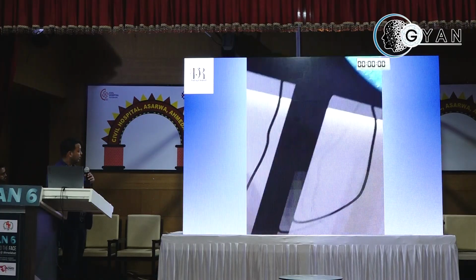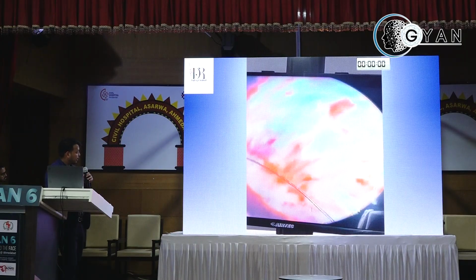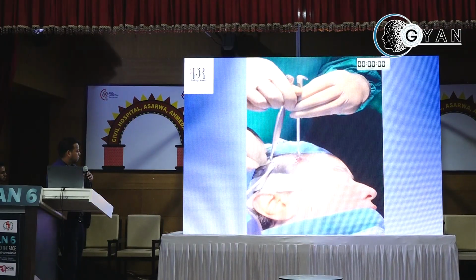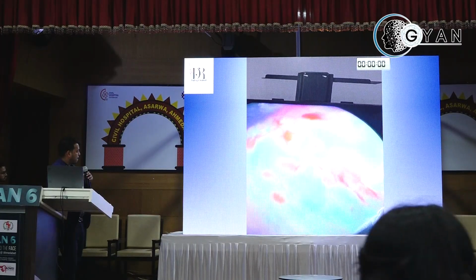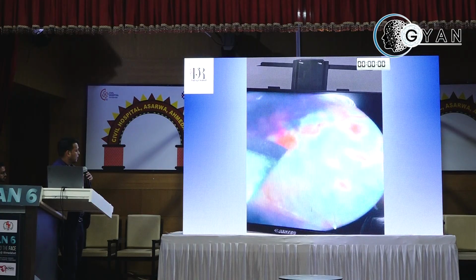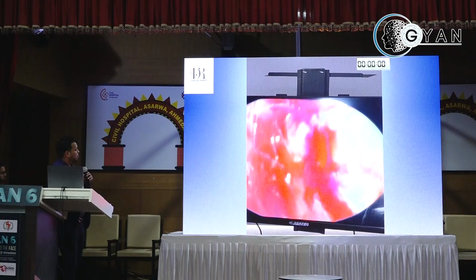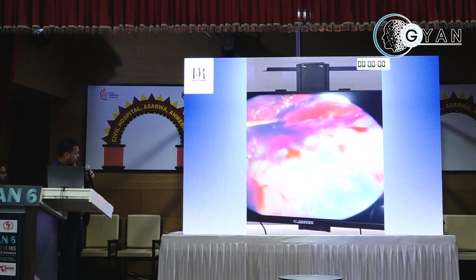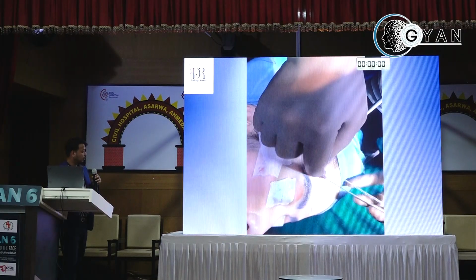Now the endoscope is inserted and we can see the markings, and with the help of the endoscope we cut the fascia. We give a small incision from the anterior to the posterior border. This is my knife, and you can see the cut. This is how we cut the fascia. This is how we harvested the fascia with a minimally invasive, small incision.